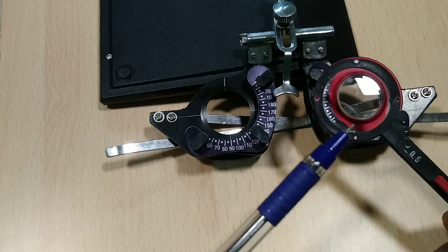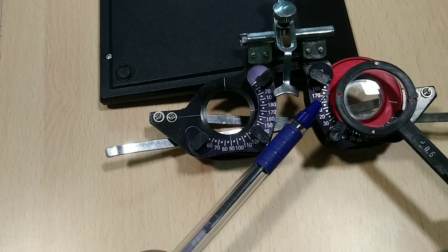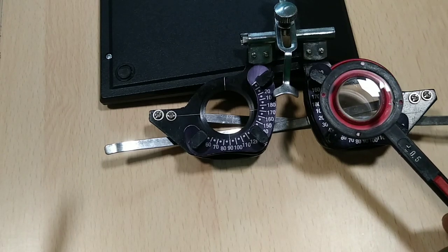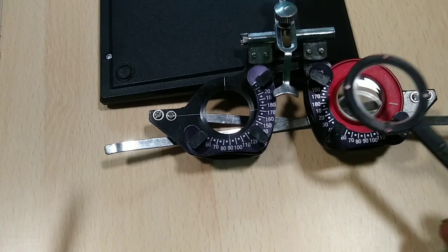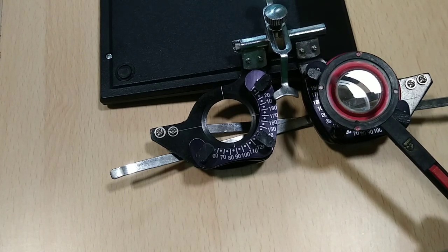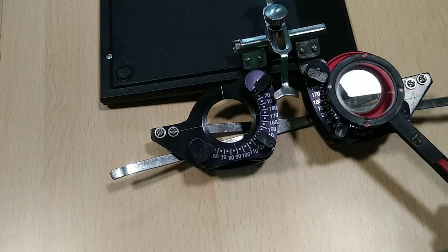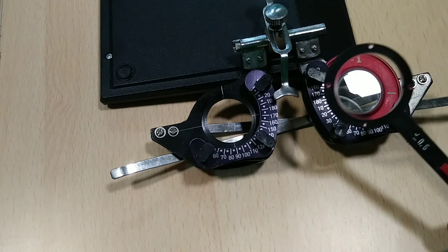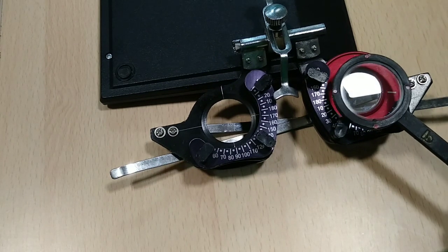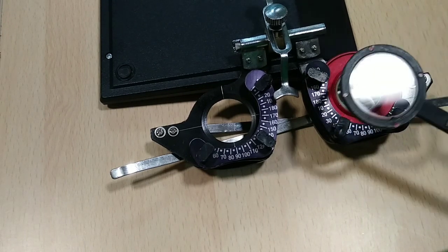For power refinement, do not worry about the handle — only ensure the dot coincides with the axis. Keep the same target and ask the patient whether position one or position two looks better. If the patient says both look blurred, the subjective cylinder power is correct. If one side looks slightly better, increase the cylinder power — for example, to 1.25 — then repeat the process until the patient says both positions look similar.